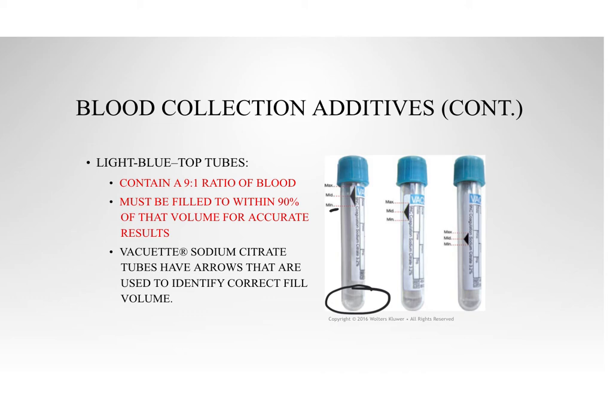Another very important thing for you as a phlebotomist to remember is that one of the questions we're going to be asking is if they are on blood thinners. The reason we ask is that if they are on blood thinners like Coumadin, heparin, anything like that, it means that when we draw their blood, we need to put extra pressure.